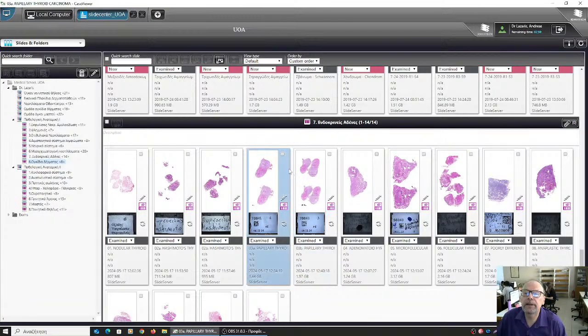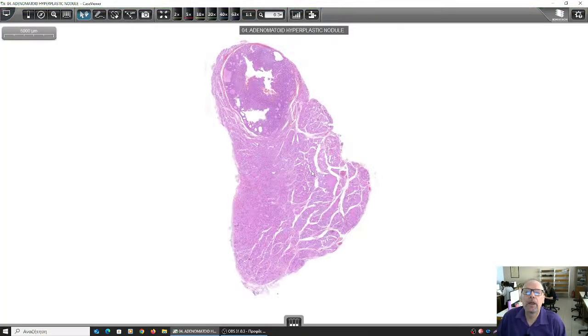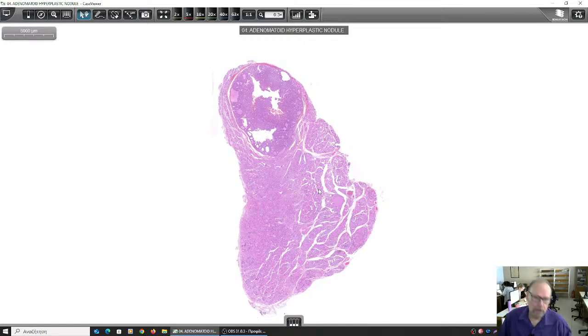Here is another papillary carcinoma. I think we are okay. Now, this one. Here we have a single nodule. So, when is a single nodule suspicious for cancer? It has to be solid, not cystic, single, and cold in the scintigram. That means that its cells will not uptake the iodine because they do not function as normal follicular cells, because they are malignant cells. So this is a sign just favoring malignancy if we have a cold nodule.